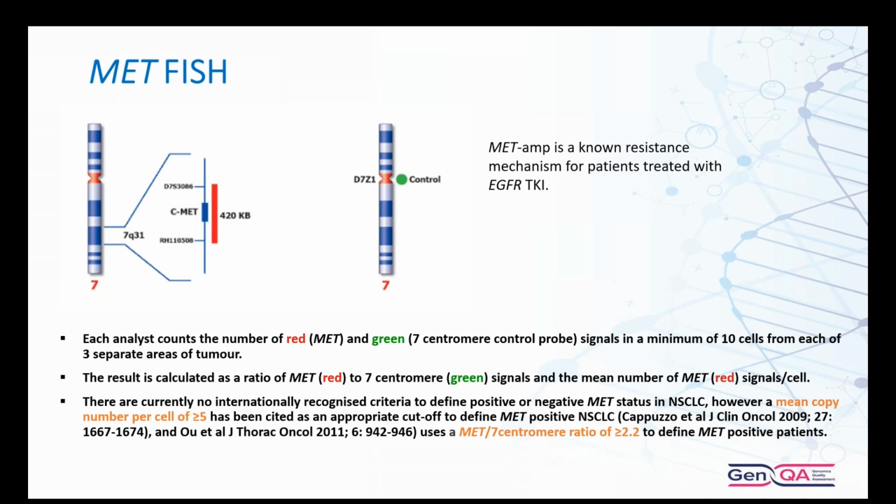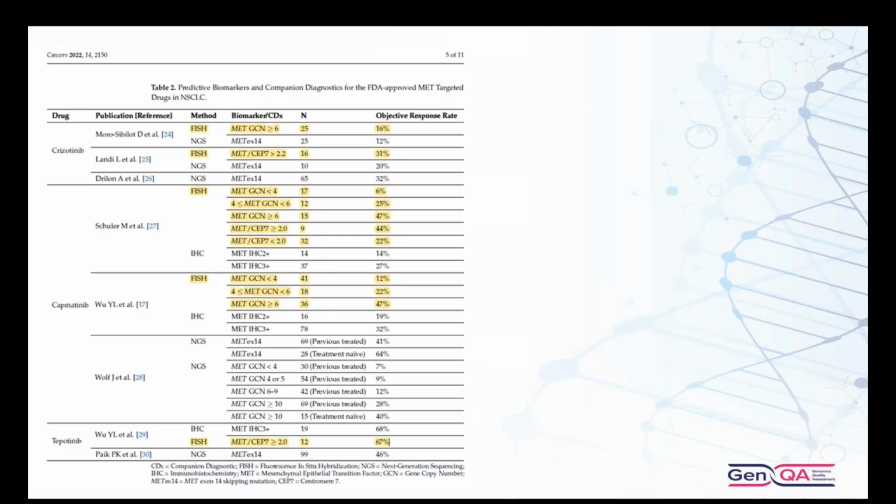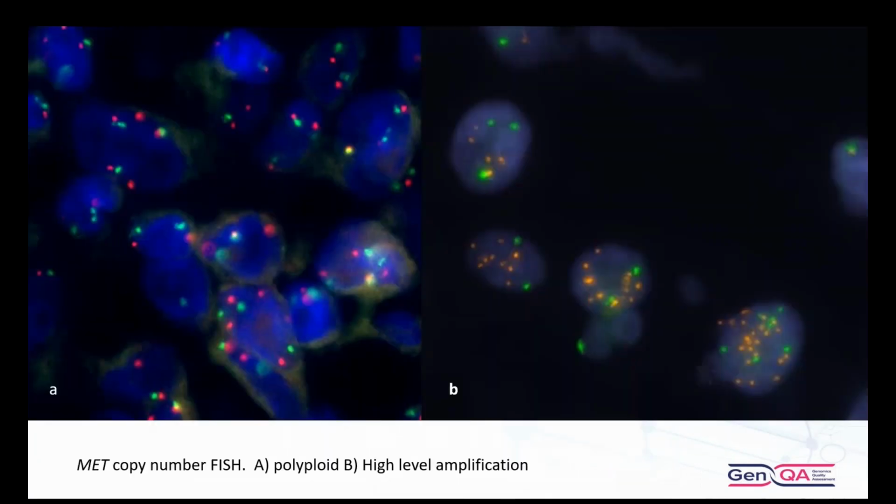The difference between MET and HER2 is that we don't have the UK recommendations that there are for breast cancer. So there are as many different studies calling things into different categories, so it's quite difficult to say with certainty what is classing as an amplification and what is polysomy, because from the FISH analysis that we do with the other probes, we know that in lung cancer, you get a lot of gains.